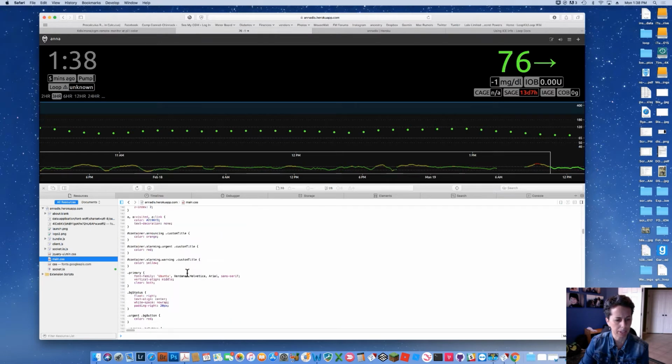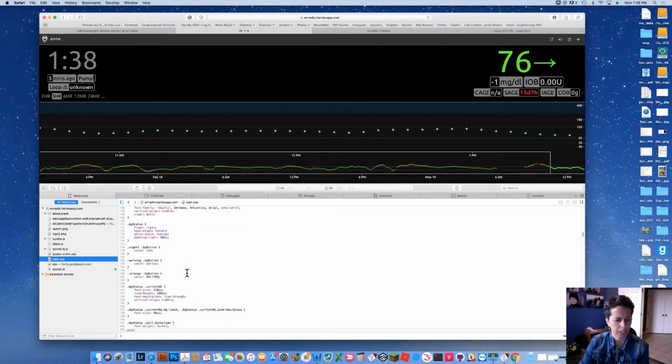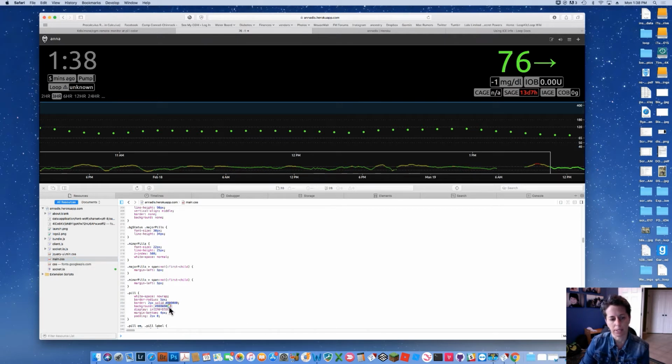I don't know, what do we want to change? Maybe we want to change, here's a good one. Let's change the background color of the pill box. We'll choose the color selector and pick a color. And did you notice this color up here underneath the current BG, those pills change color. And you can change them on the wheel and you can see in real time how those look.